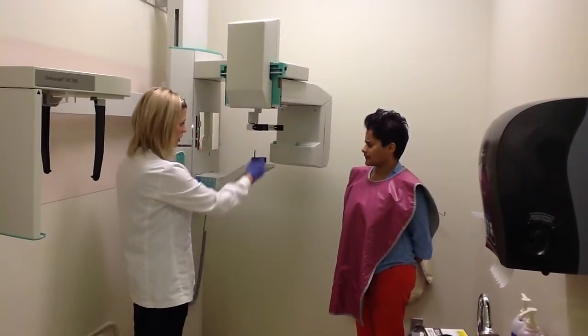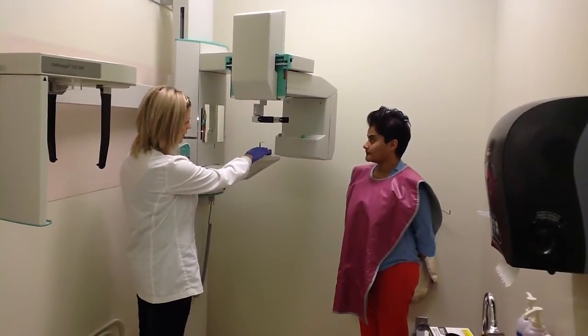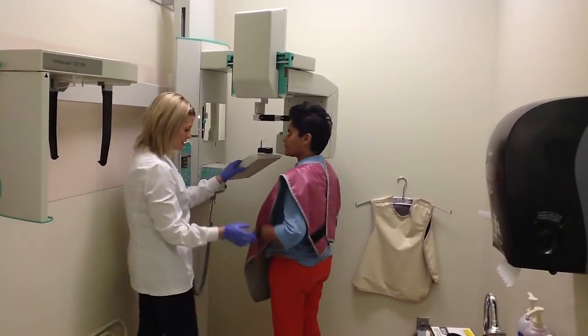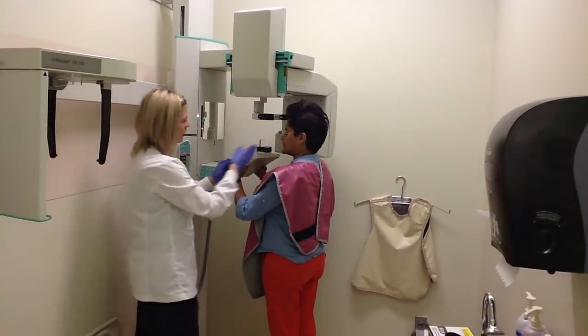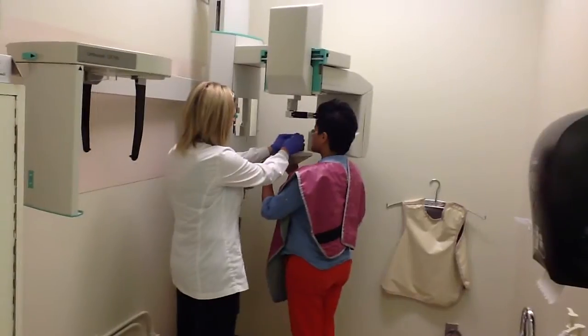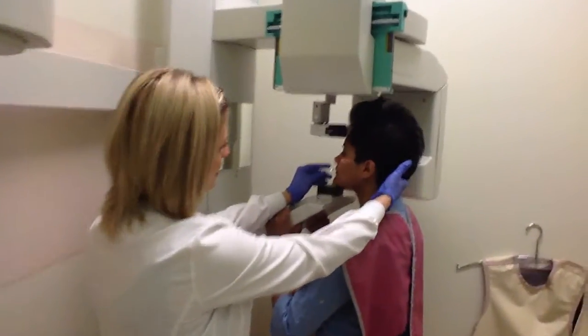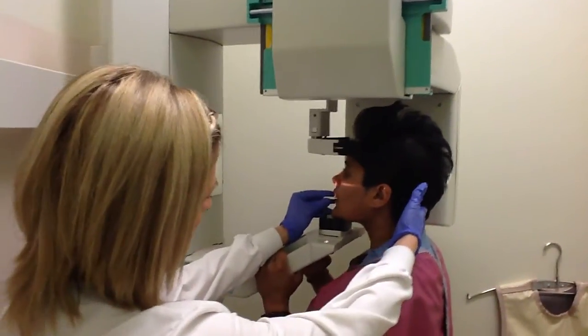I'm going to raise it up for you a little bit here. There you go. Okay, so are you okay? You can come in and hold onto the handles. You can place your hands here to support you. Okay. And you can come forward. And I'm going to get you to see that little groove there. You could bite on that for me. So you can help bring in and support your patient and guide them to the stick.